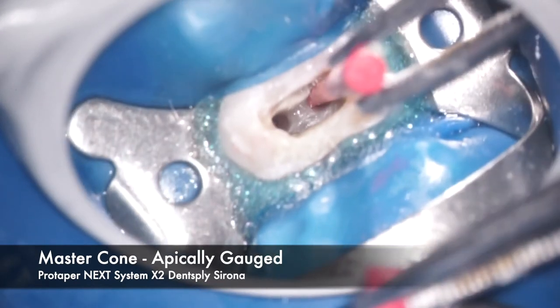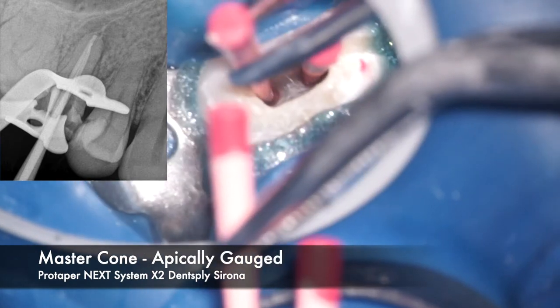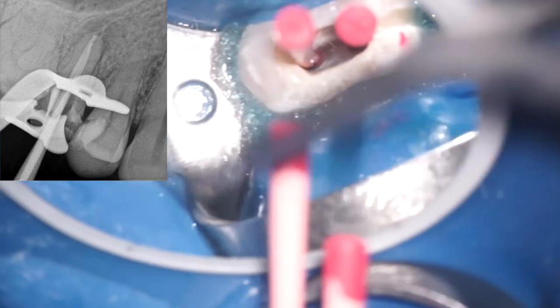After basic shaping is completed, we continue our irrigation protocol with alternate sodium hypochlorite and EDTA and activate it. We then gauge our master cones, just as we gauged our canals. You can notice a slight curve in the palatal canal as it curves toward the buccal, since both canals are joining together at the junction of the apical and middle third.